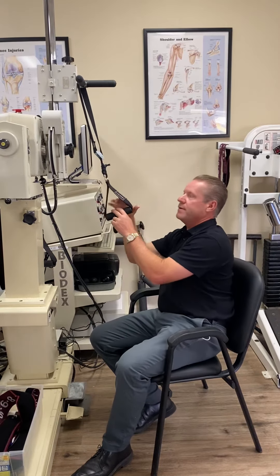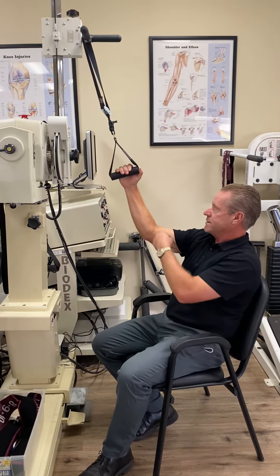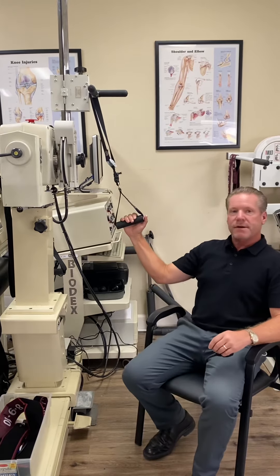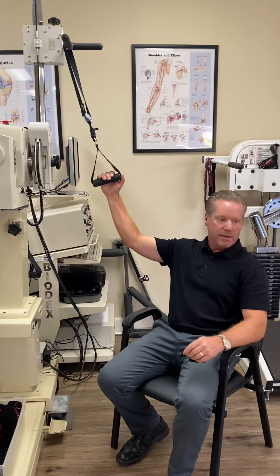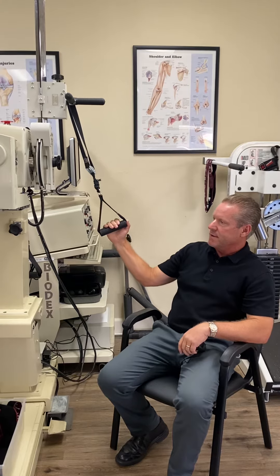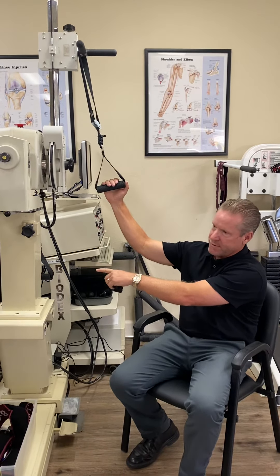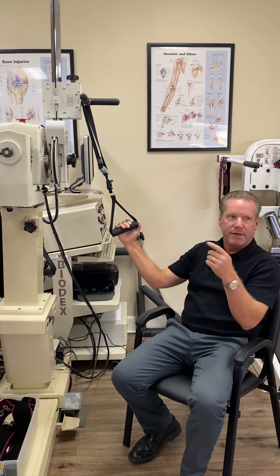As the clinician, you can go and dial up the percent closer to a hundred as the person is able to tolerate. They can let go anytime they want. They can work different angles — we have a lot more variety and we're not sticking people out into the walkway. My preference would be to use this for shoulder elevation, that one for internal/external rotation, that one for knees, and then we don't have to be resetting things up every time.